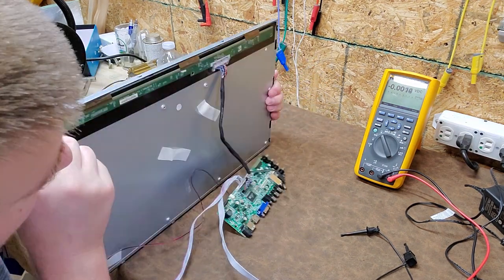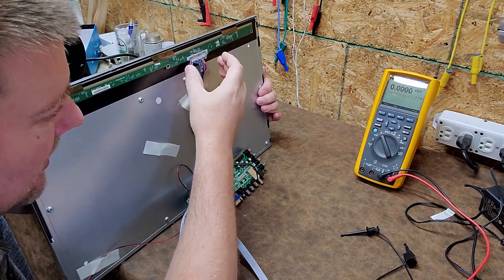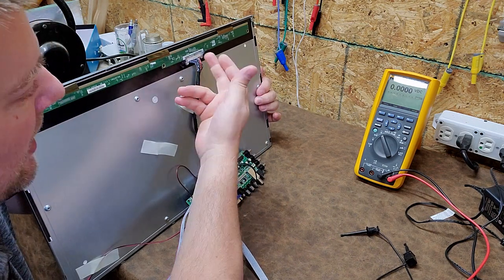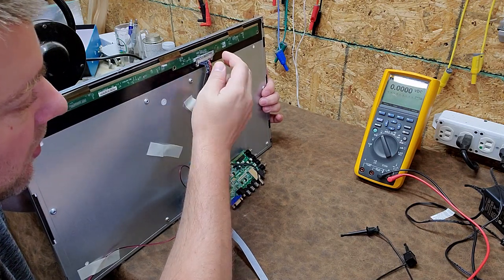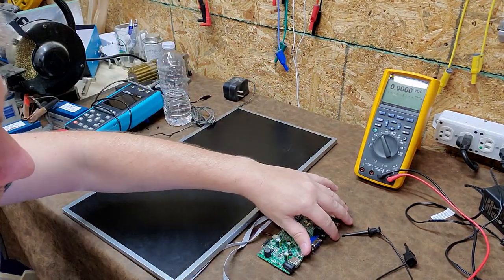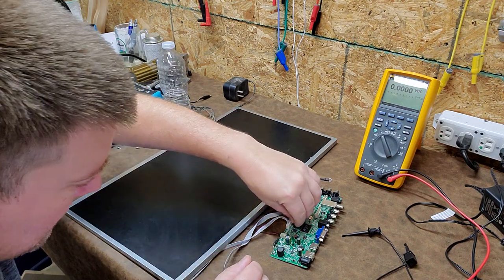So the symptom is that the unit was not powering on. Black display. So the first thing I noticed is right on the back, there was a ribbon connector right here, or a flat blade connector is probably more accurate. And it was a little canted in its socket. So one of the first things I did is I inspected the socket, and then I placed it back in the proper orientation. And then I secured the cable with hot glue, which is actually pretty similar to what a lot of Chinese companies are doing anyway with electronics. Hot glue is an insulator, and it does add functional support. So that's good. So now I know my cable is good.